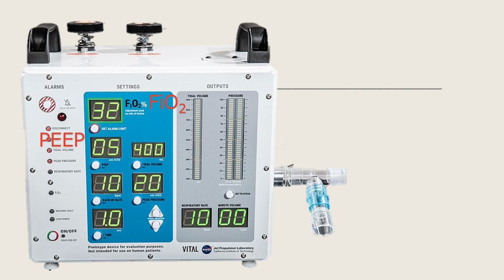Now, how about ventilation? Ventilation means gas exchange, and it's measured by carbon dioxide. And so for that, we're going to use tidal volume and respiratory rate. What does that mean? Minute ventilation, that is how much volume of air goes in and out of your alveoli per minute, equals the volume per breath, called tidal volume, multiplied by the respiratory rate, which is how many times you breathe per minute.